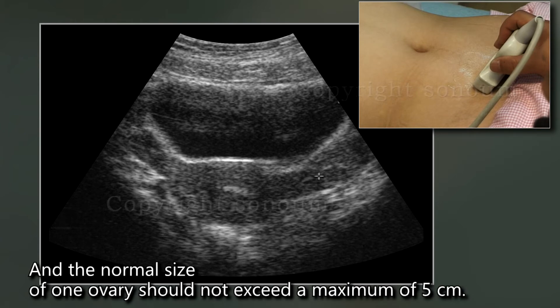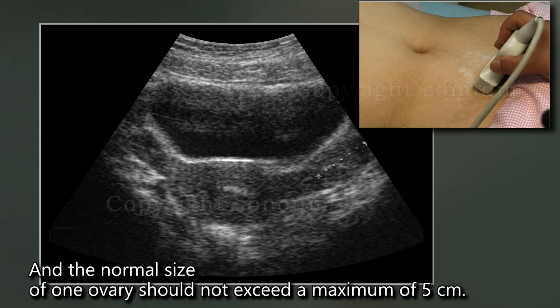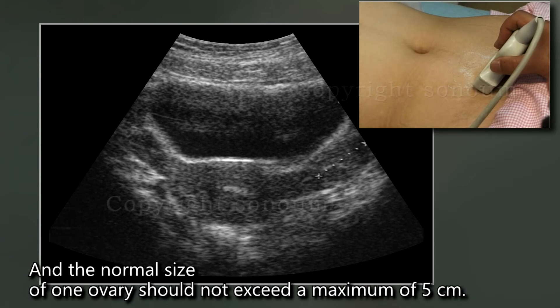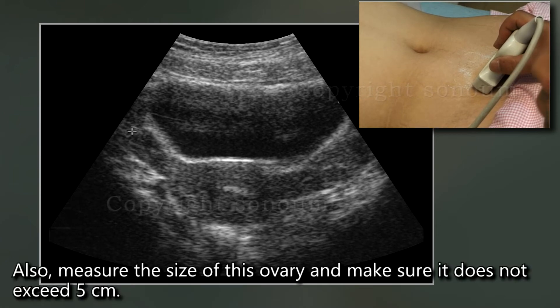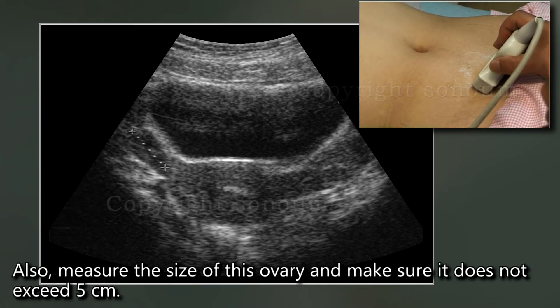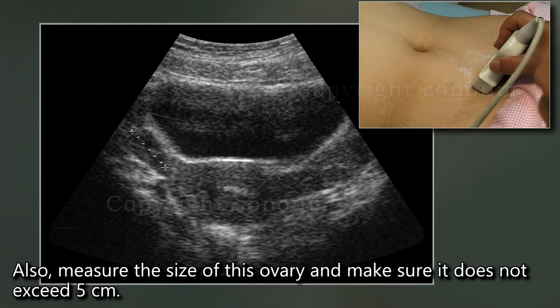The normal size of one ovary should not exceed a maximum of 5 cm. It is now shown in a round shape. Measure the size of this ovary and make sure it does not exceed 5 cm.